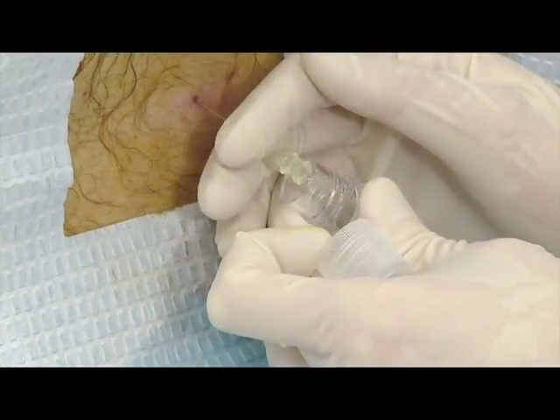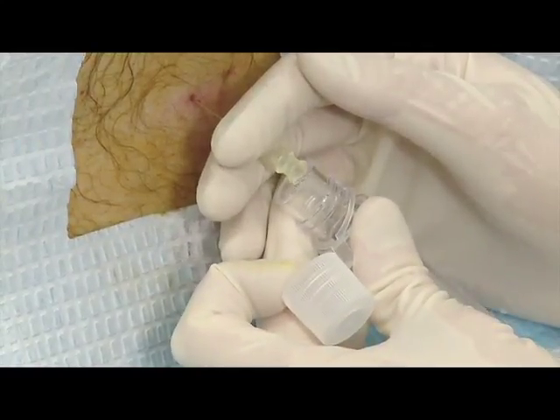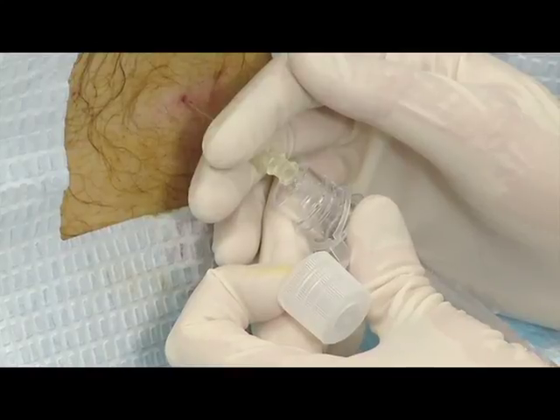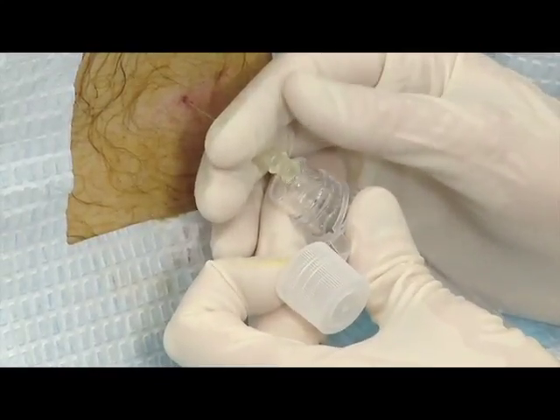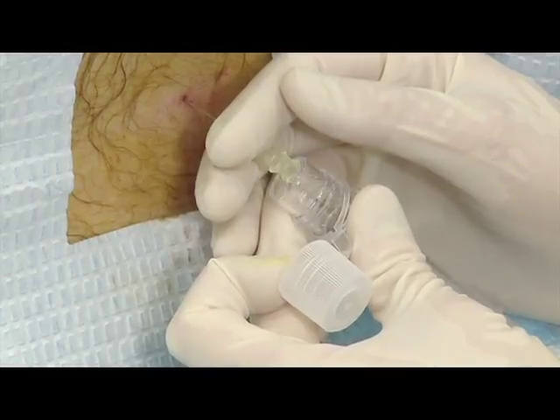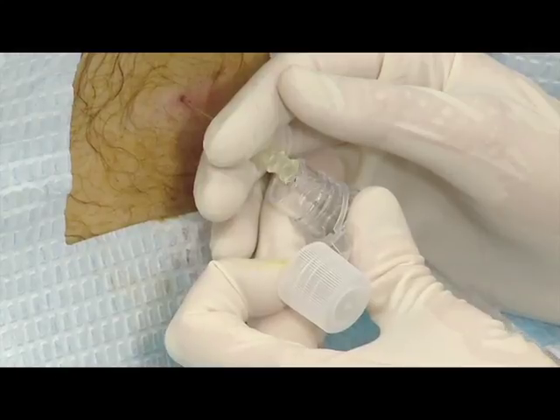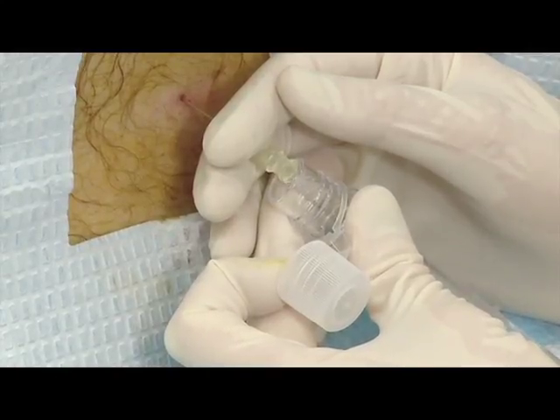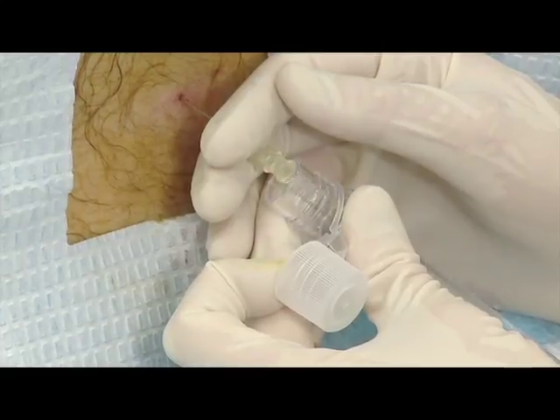Collect fluid in each of the 4 tubes, at least 3 to 4 cc's in each tube, unless cytology is indicated, in which case at least 5 cc's is required for best results. It is important to note that a traumatic tap may look slightly bloody or pink, but should clear with each successive tube. If therapeutically indicated, larger volumes of CSF may be removed, up to 40 cc's.